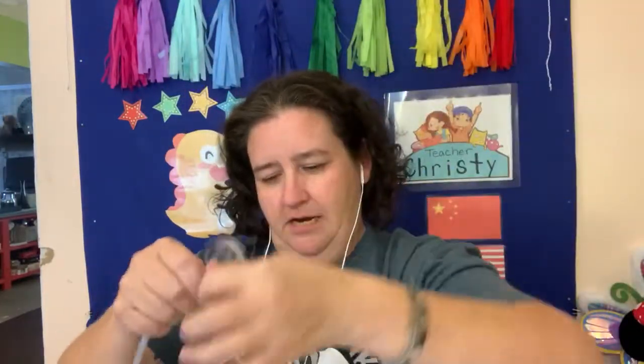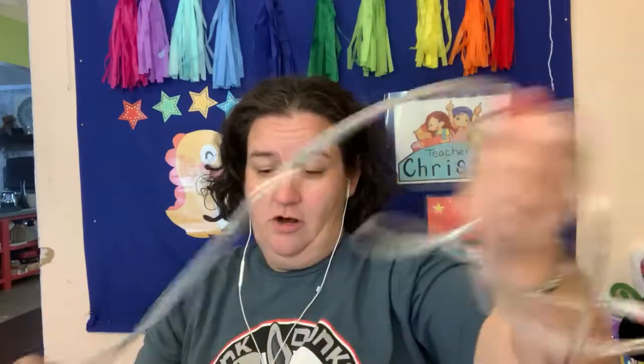Some people don't like it looping behind their ears, which is technically the right way. You can also put it on like a necklace — making sure the contours are right — attach it, pull the back tight, tighten the bolo, and make sure it's above the ears. This is not as comfortable if you're sleeping because of the lump in the back. The nasal cannula is a low-flow device because it does not meet all the patient's demands.